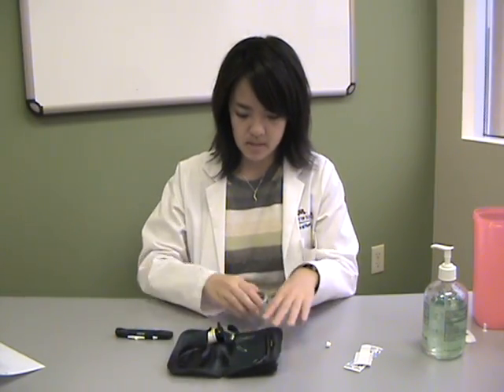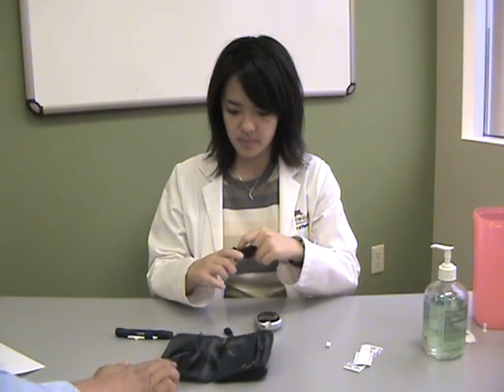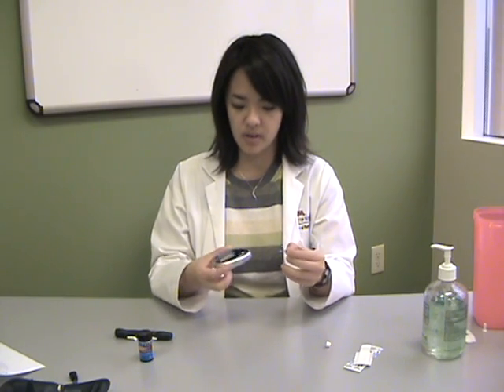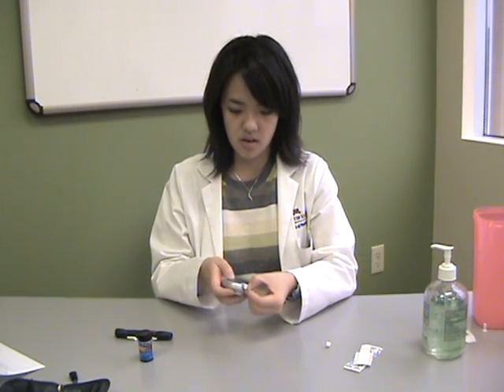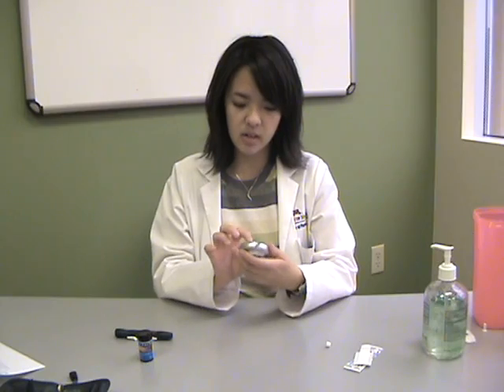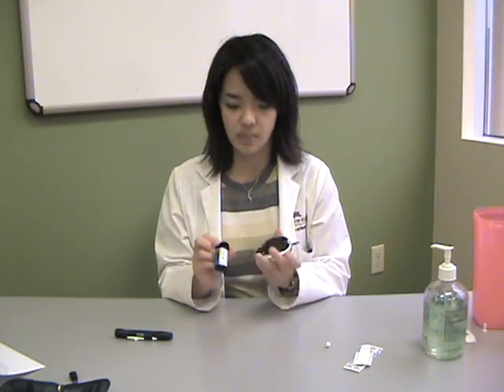We will now set up your glucometer. Take your glucometer and your bottle of strips. Remove a strip from the bottle. Next, you will insert the strip into the meter, and this will turn the meter on. Check the code on the meter with the code on the bottle to make sure that they match up.